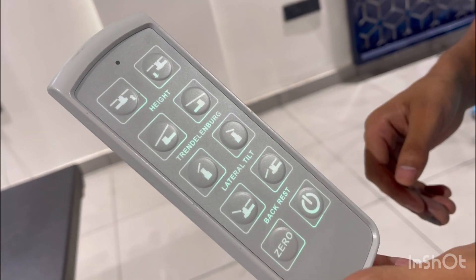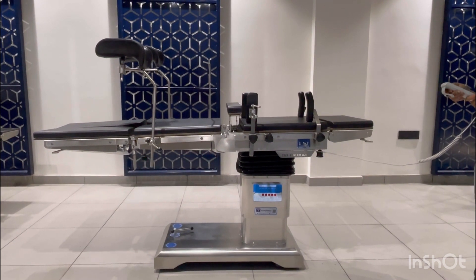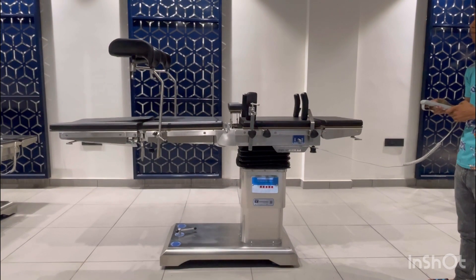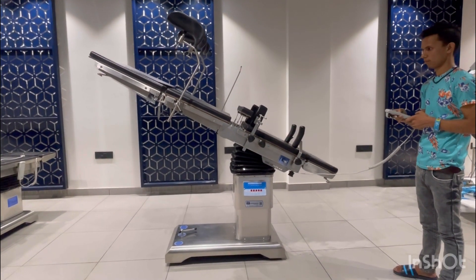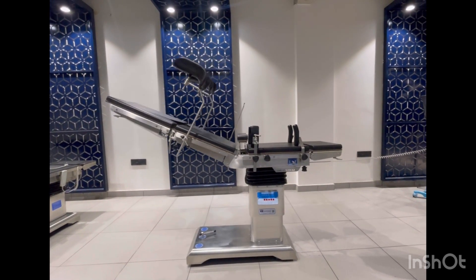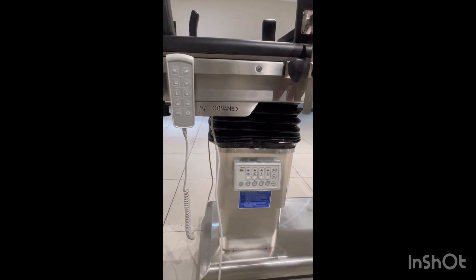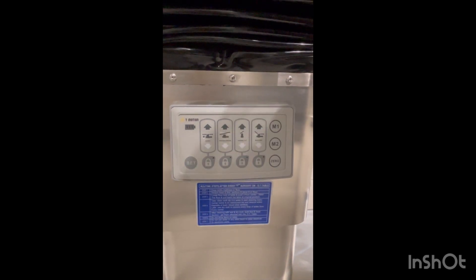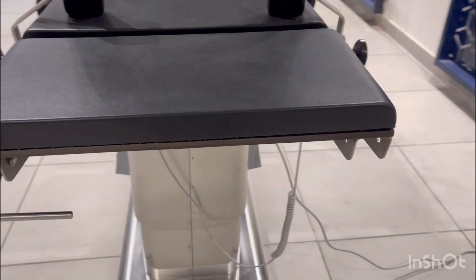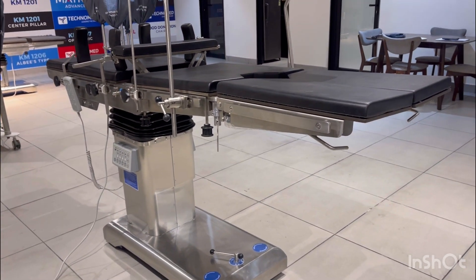The table operates electrically by the help of a remote. It also has a nurse panel in the column, and you can operate it in boarding mode.